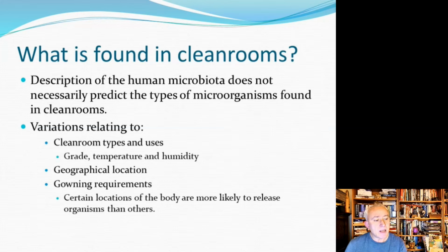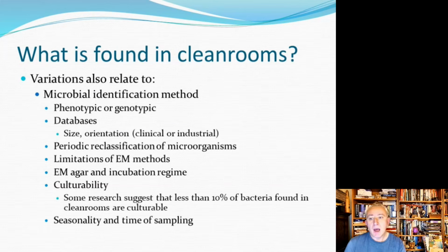With microbial identification, there are going to be variations in the method. That's very much dependent upon the database, whether it has a clinical bias or not. Even very popular technologies like MALDI-TOF are still limited to a degree in what they can recover, and sometimes they throw up very strange organisms, which is why you would need a microbiologist to interpret those findings.